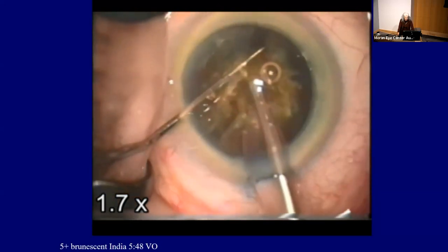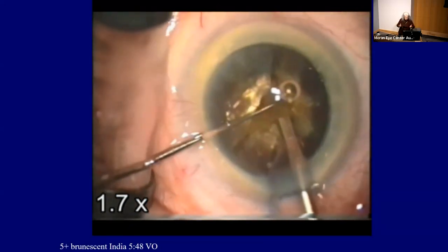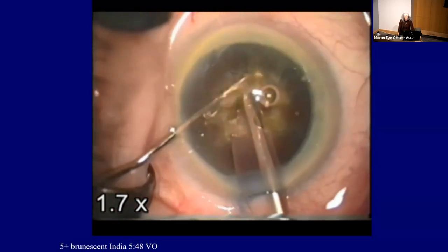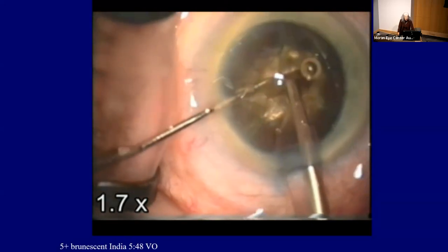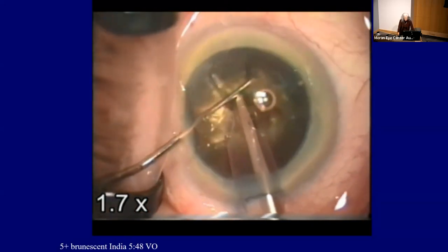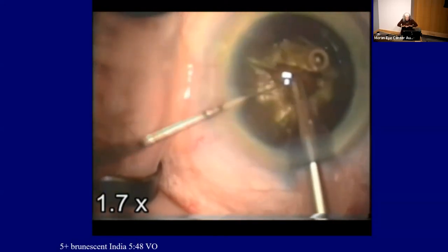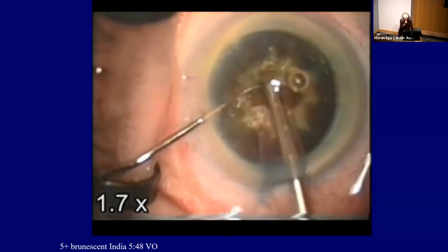If I want to crack all the way through the bottom, I've got to drag those two halves all the way to the edges, and I'm going to stress my zonules and risk breaking my posterior capsule. And there's no need for that. In fact, I don't want that. I want the epinucleus, which is thick, those interdigitated leathery fibers at the back, the posterior plate, that are really the issue with these lenses.